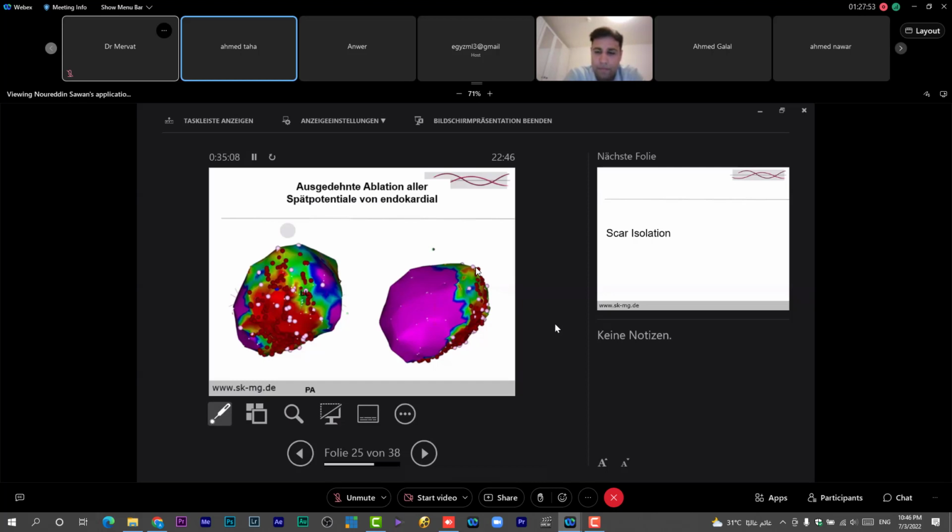But as I said, from the initiation of the QRS complex, for example the ascending limb, you can get more information. For example, if the ascending limb is very slow, it means that you are in very late potentials, like a slow zone, a very slow zone. And this is a very, very important point of view. These slow zones can be a good point for ablation, even if it's a corridor, for example at the entrance point or something like that.